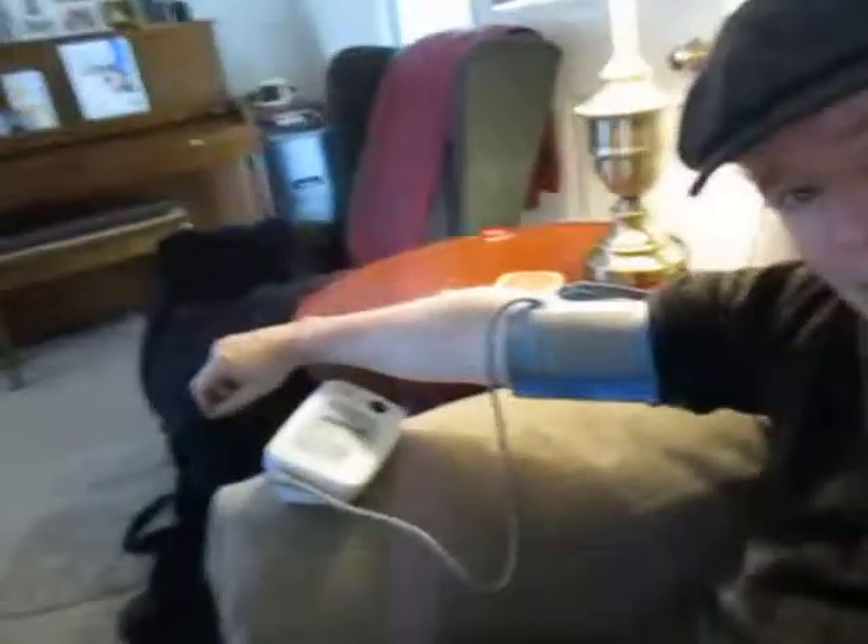Hi, you want to see something strange? Okay, here's one blood pressure monitor and here is another blood pressure monitor. This one is connected to my right arm and my left arm, and up here this one's connected to my right arm. I'm going to turn them on all at the same time.